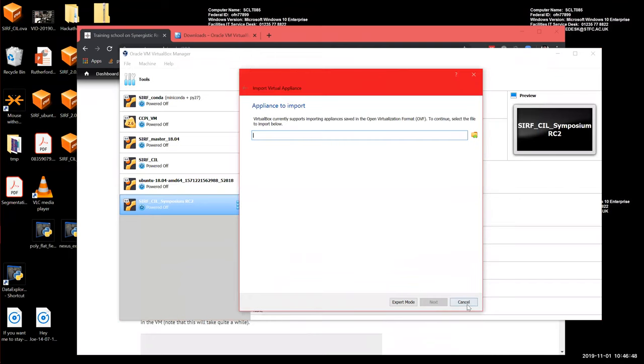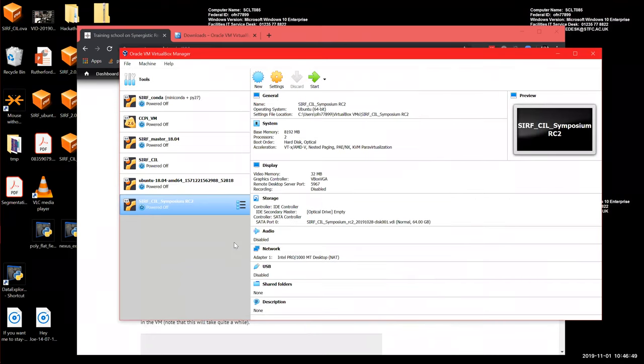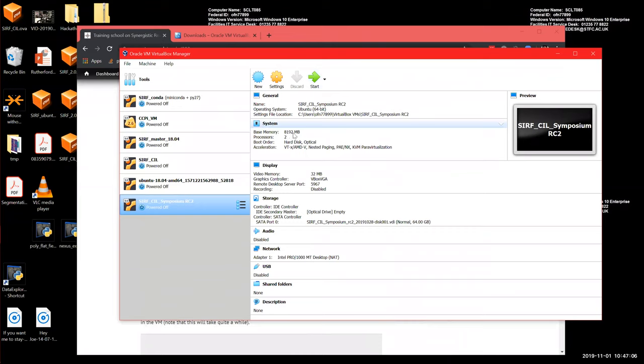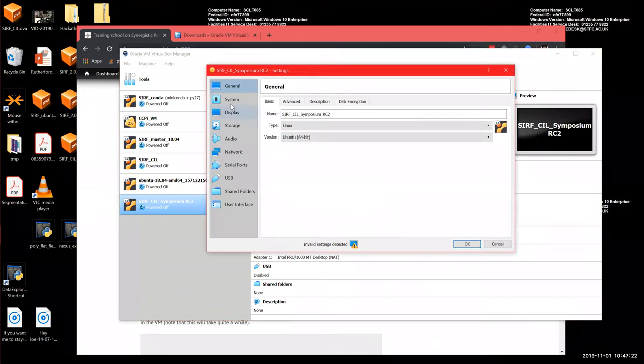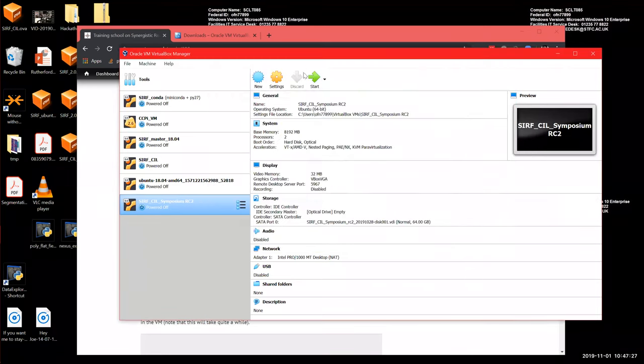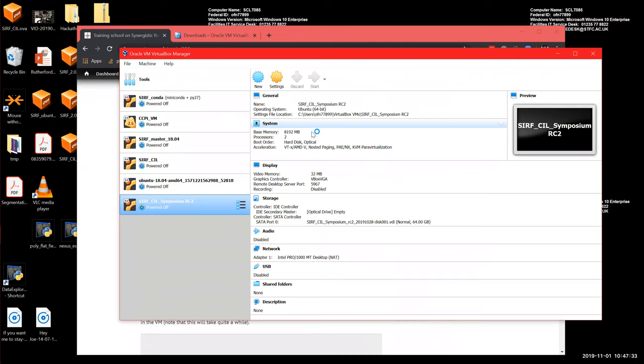So I've done it already, so it should be fine. Now, you can start the machine by clicking here. Just I modified this virtual machine to have eight gigabytes of memory available. The one you've downloaded only has four. So this doesn't mean that the virtual machine will use all this memory from your host. It will potentially use it. You will change it by settings, system, and then there's this slider. Okay, so we start. So it will take a few seconds to start.